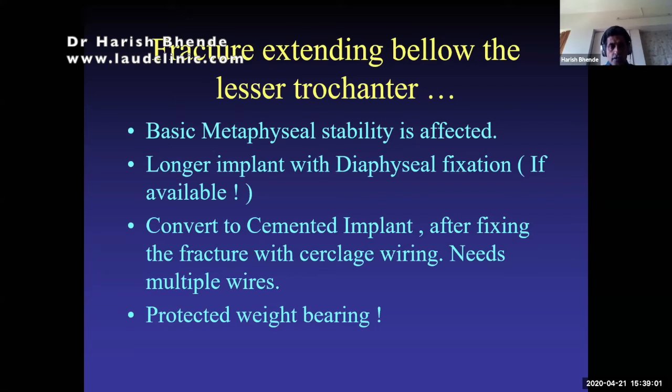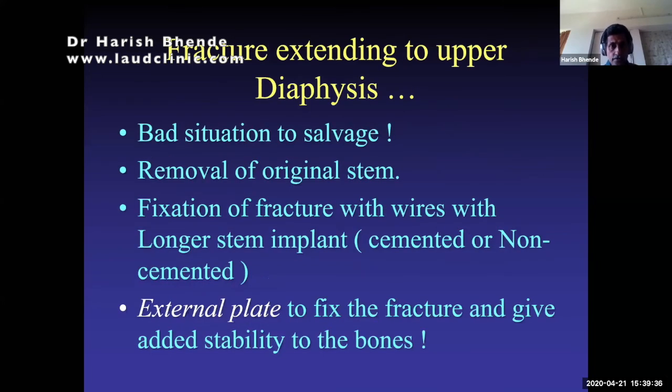So basically, we have to be careful when you see the fracture. You have to increase your exposure. It is very important that you feel there is a fracture. Don't be hesitant to expose more. Go down all the way till you can see the lower end of the crack with your own eyes. It's very important to realize this. Otherwise, the crack may have gone much deeper or much more distal than what you actually expect, and then you will do a half-hearted intraop assessment, and eventually the implant will become loose and fail.